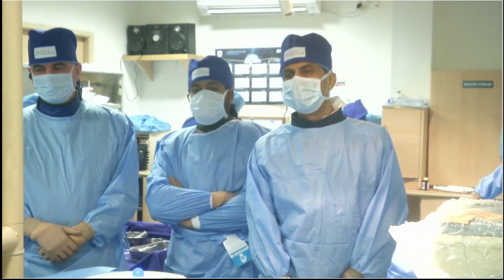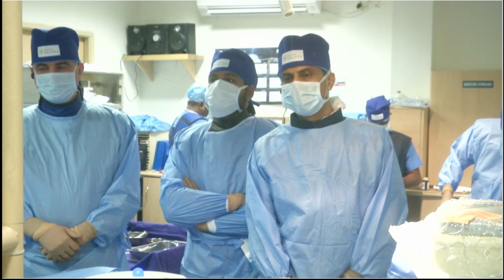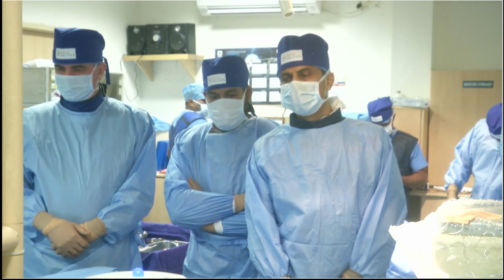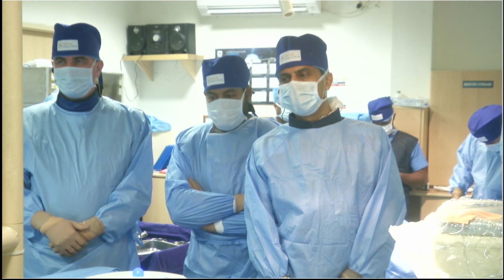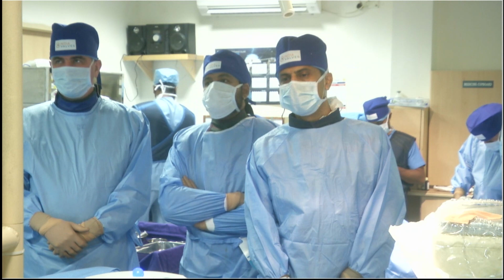I think we have an intermediate risk patient who had relatively simple aortic stenosis, except for the fact that there is a bicuspid valve with a lot of calcification, and the fact that the left main is relatively low, 9 millimeters from the annulus.